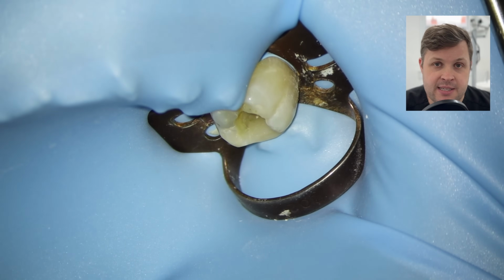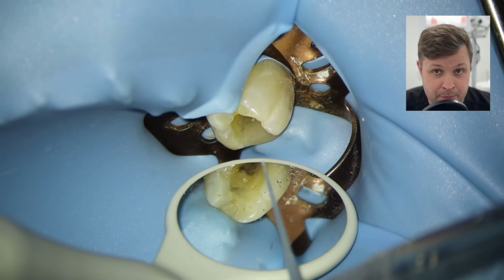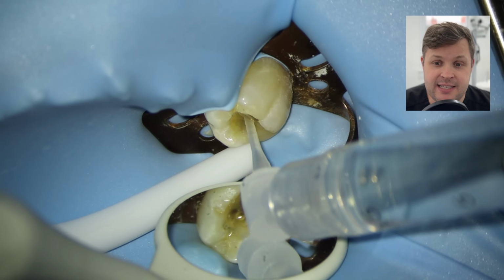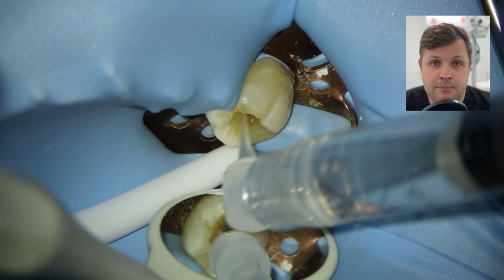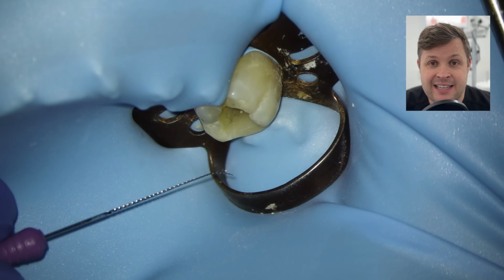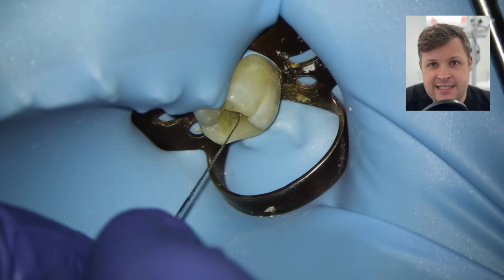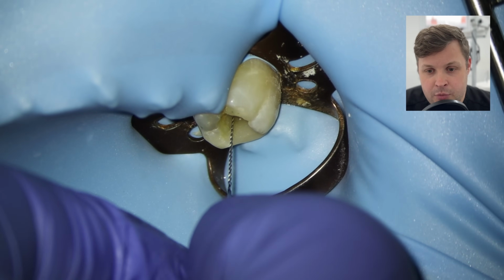So what I'm thinking to myself now is that maybe going from an 8 to a 15 was probably a bit too much of a jump. You know, sometimes it's fine, but in this case it's too much of a diameter change. And what I'm going to do is move down with a size 10K file again with a little bend at the end. And as I use this size 10K file, I do get patency again, so I'm moving up a little bit.